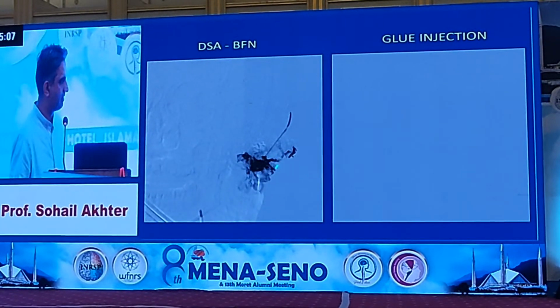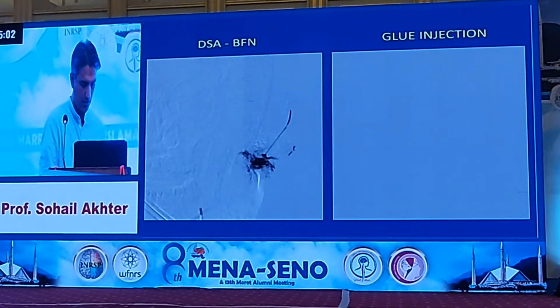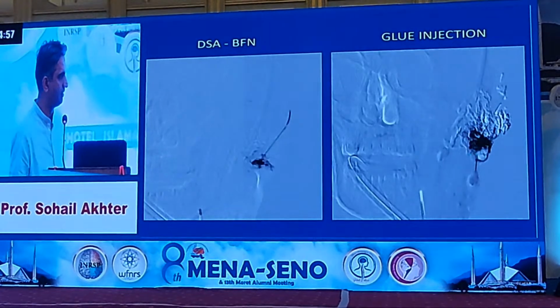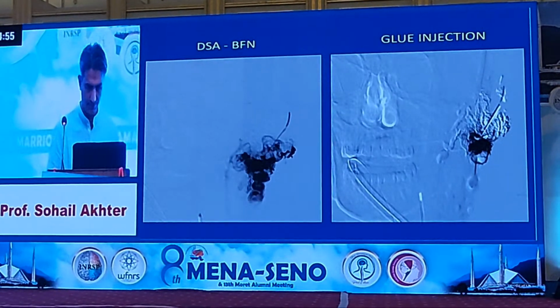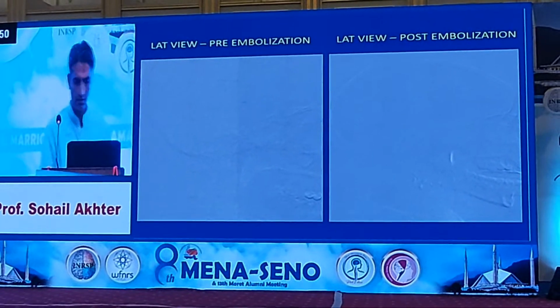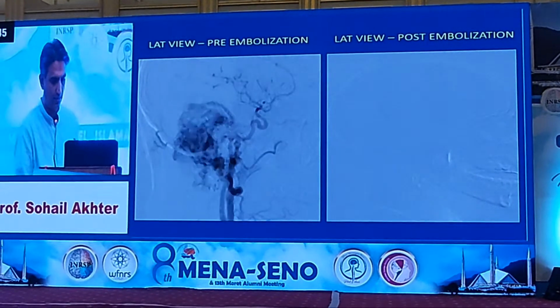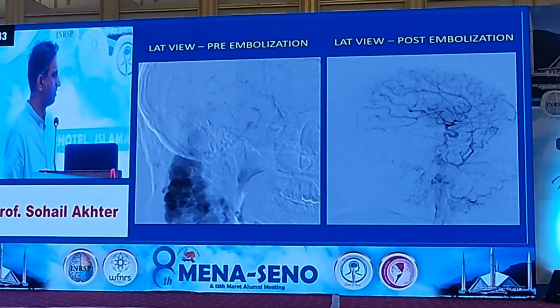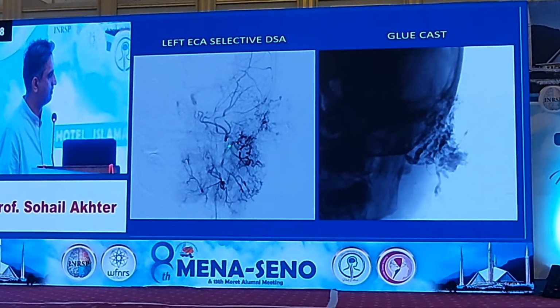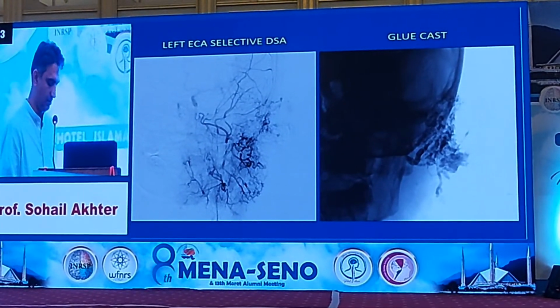Again, at the second site, needle puncture was done, and just see how the glue injection is completely covering the nidus. So this is a pre-embolization run. ECA run, a slightly delayed image, and it's the glue cast, which you can easily appreciate in this.